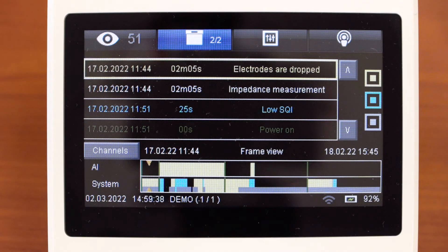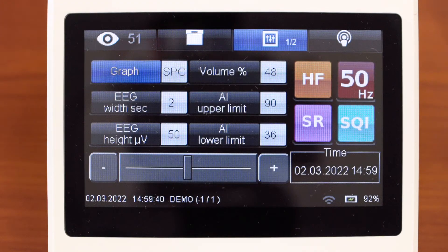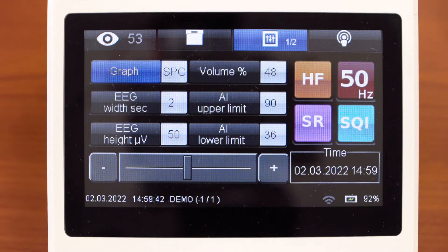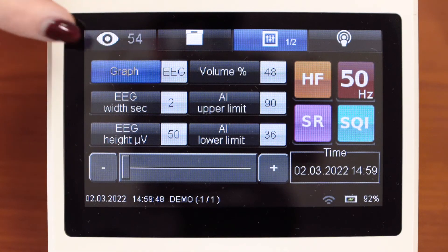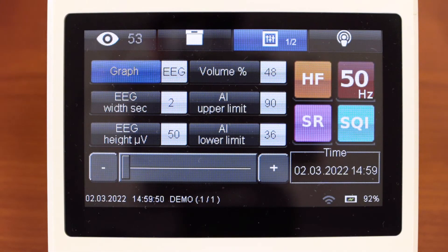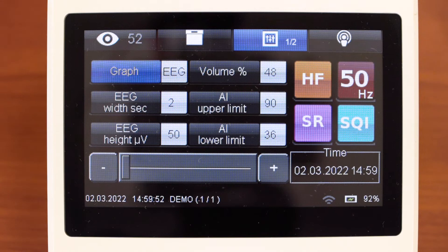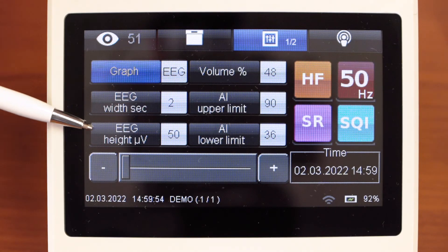The next window is settings. Here you can change the type of graph between spectrum view and EEG native view. You can change EEG width and height.